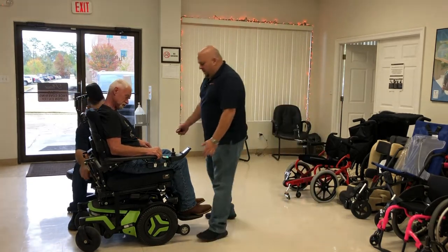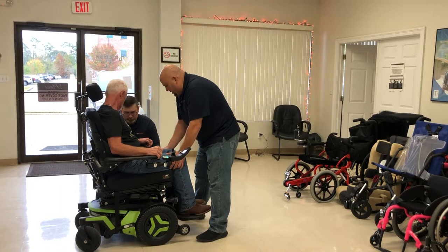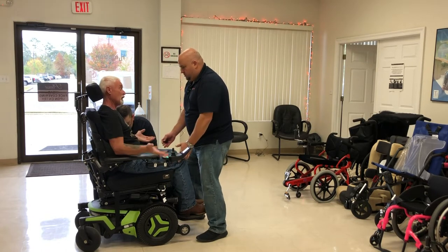I took those side pads off right now because you don't really need them with the independence and mobility that you have — I think they'd get in the way. But those pads, if you ever need them, we can put them right here and they'll help keep you from being too scrunched.